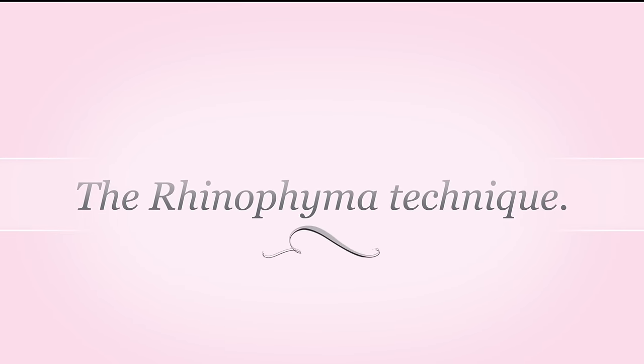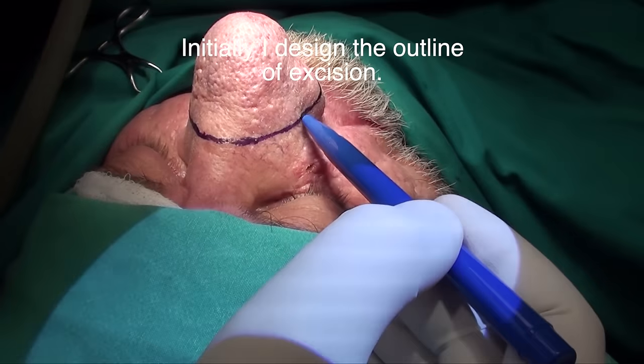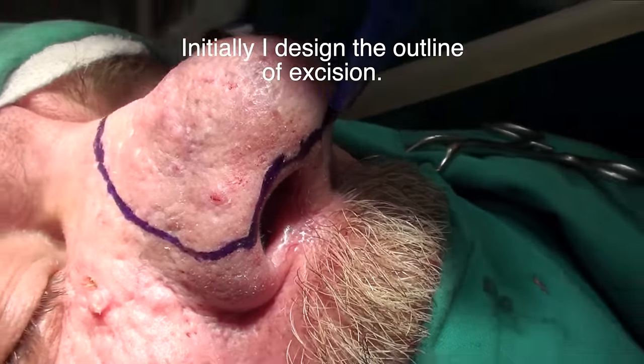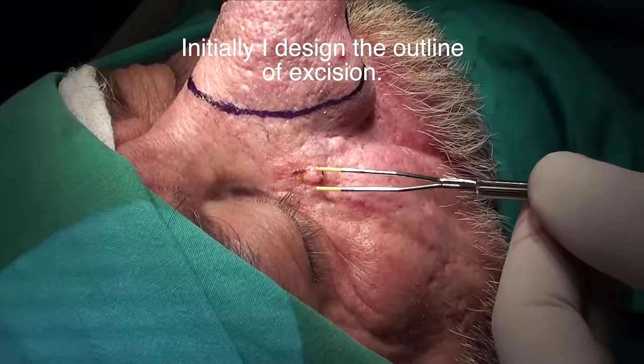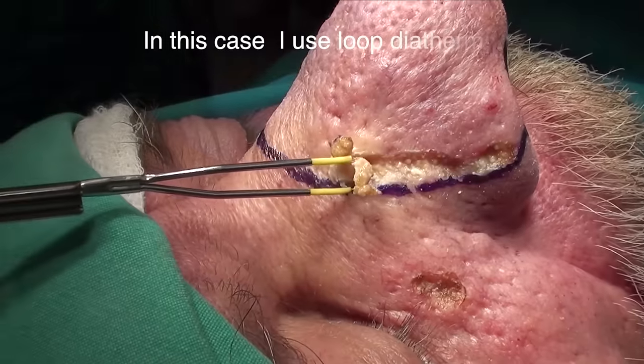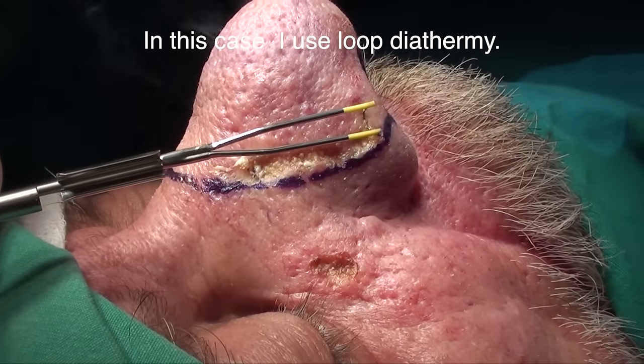The Rhinophyma technique. Initially I design the outline of excision. In this case I use loop diathermy.